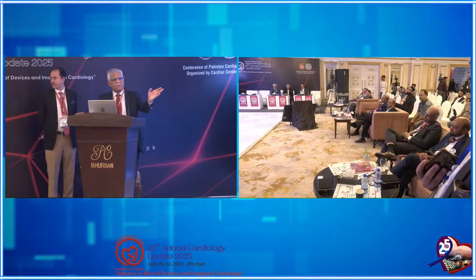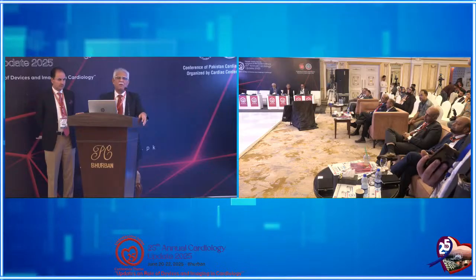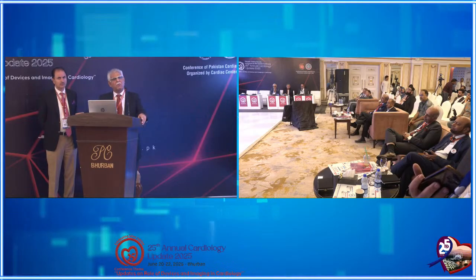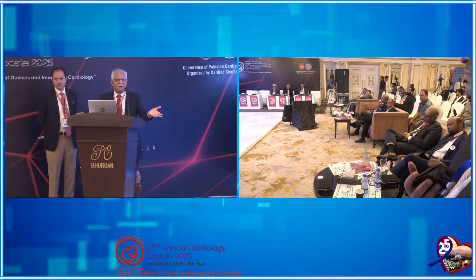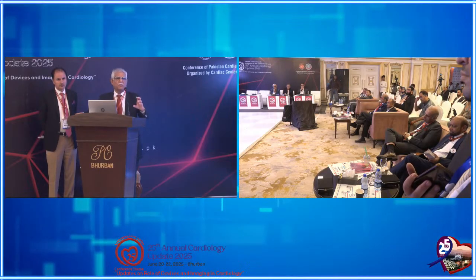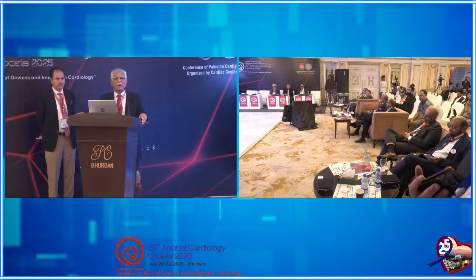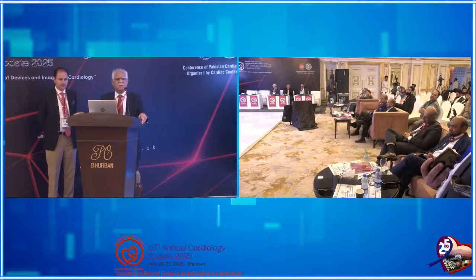But as the earlier speaker said that the negative predictive value is 100%, I don't agree with that. It would be 100% only if you have excluded all patients with technical artifacts and the limitations of the CTA, and only include those patients who have excellent images. Only then will you be able to exclude coronary artery disease with 100% certainty. Otherwise, no test is 100% accurate.